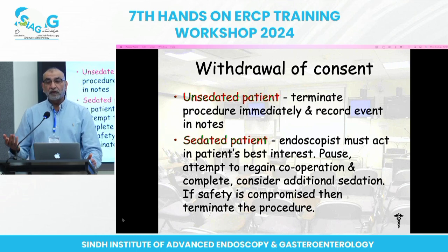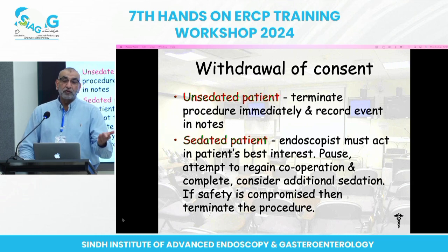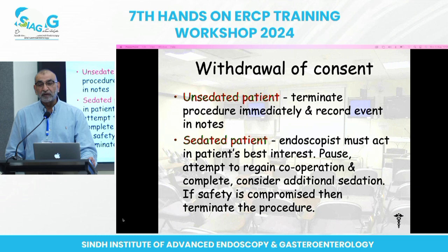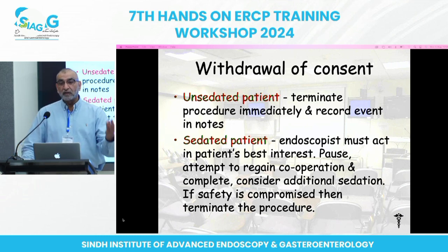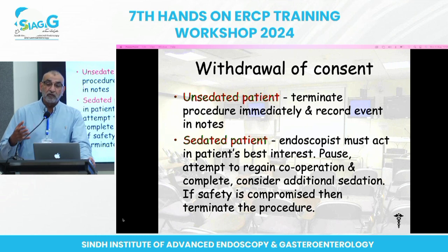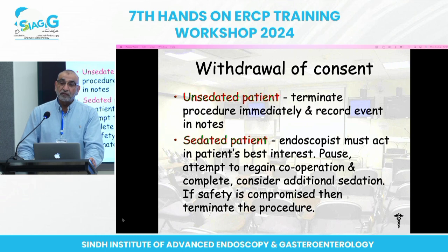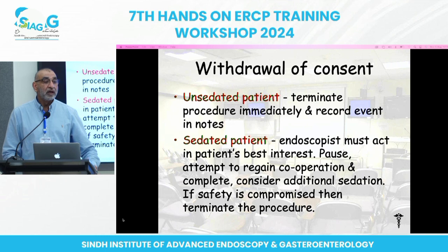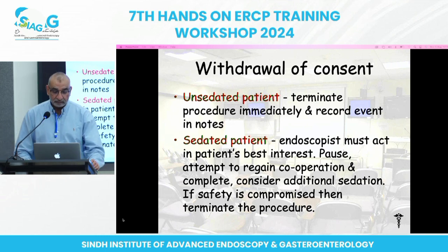Because most of our colonoscopies we do without sedation. Hardly any, very few of my patients require it. So if it's your technique, you can get somebody more experienced to do it for you, or even on a different day, it might be different for the patient, because sometimes if you've insufflated too much gas into the colon, it makes it very uncomfortable. Especially if you do OGD and colonoscopy in the same session, then colonoscopy becomes more challenging because most of the air tracks down to the colon, and it makes it more difficult for them.